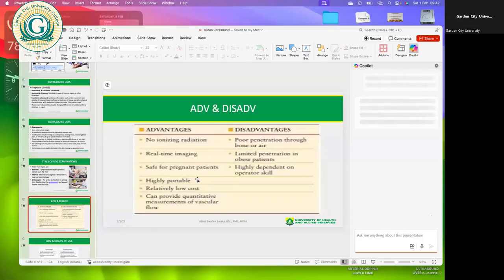For ultrasound, you are able to also get quantitative measurement of certain structures. Although you can get subjective information from ultrasound, there is so much objective information you can actually get. The BPD, for instance, can be specifically obtained. The femur length can be specifically obtained. It is objective. You can actually measure it, and it's repeatable. You can measure and then do it again and get a similar value.